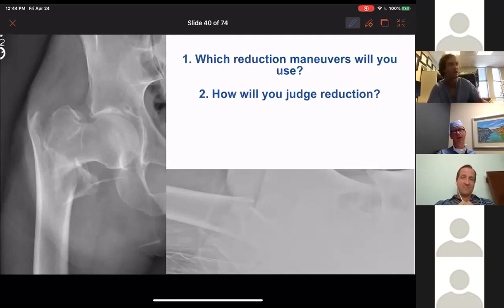So yes, I'm constantly obsessing on the position of the beam, the position of the distal fragment, and trying to judge how much version I have now given them, and trying to interpret the multiple radiographic clues that I have. But other than a mishmash of that, I'm waiting for the method.